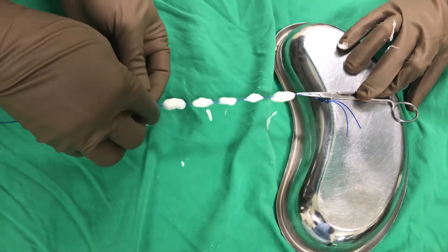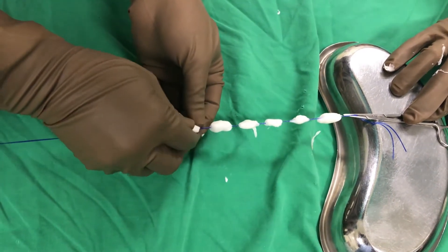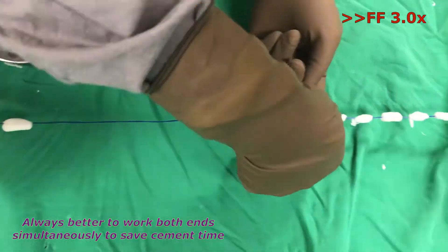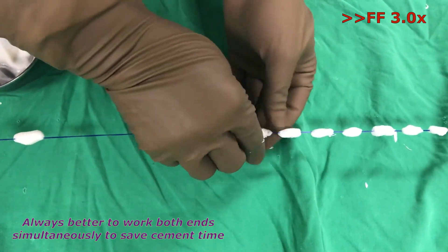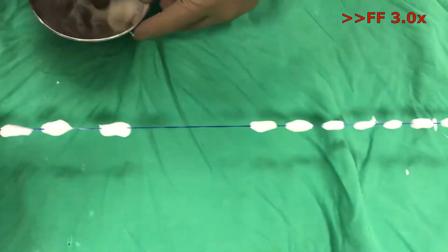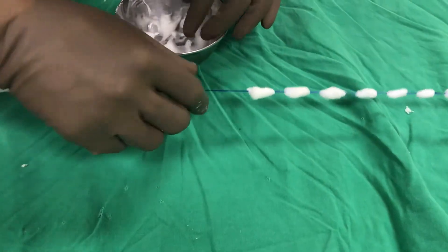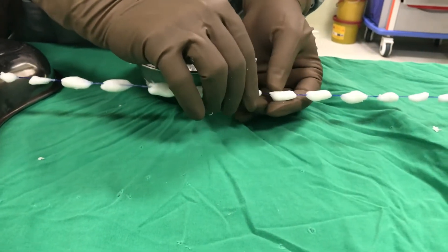We have two personnel doing the same work from both ends of the suture, which makes it more easy, quick and comfortable. These beads are almost ready and are a good spacer for eradication of infection in soft tissue spaces — that is, extra-medullary spaces.